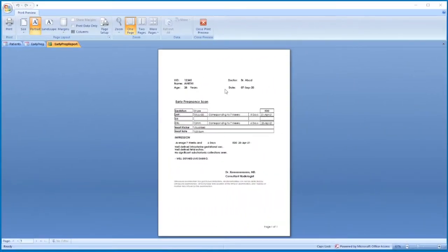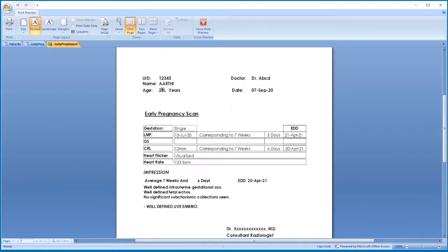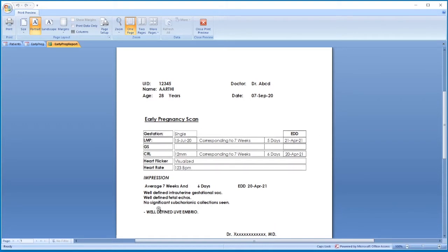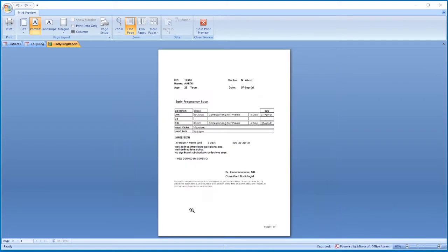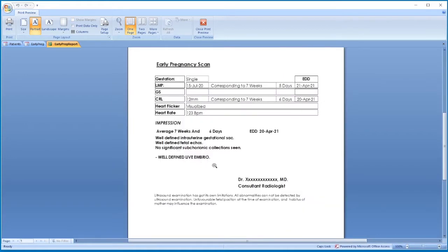Then print it. This is the printout. The patient details are shown here, and the LMP with corresponding weeks and days, CRL with corresponding weeks and days are automatically calculated, and the template is shown here.